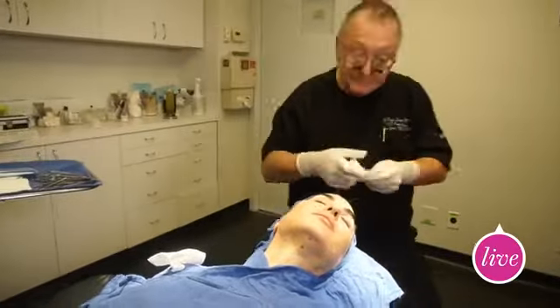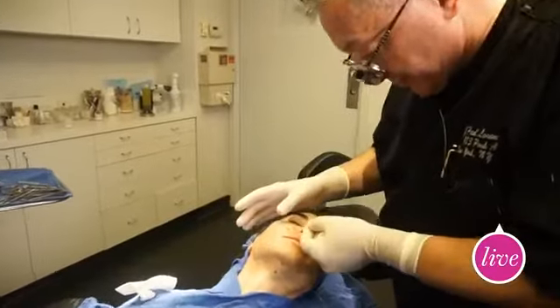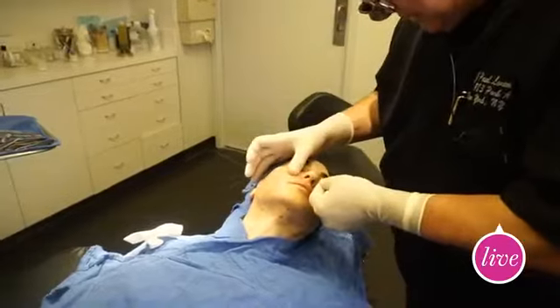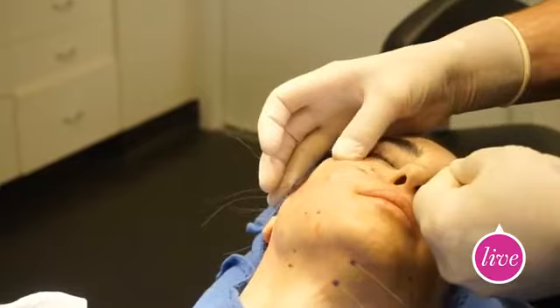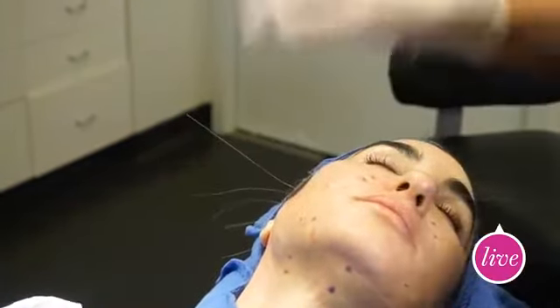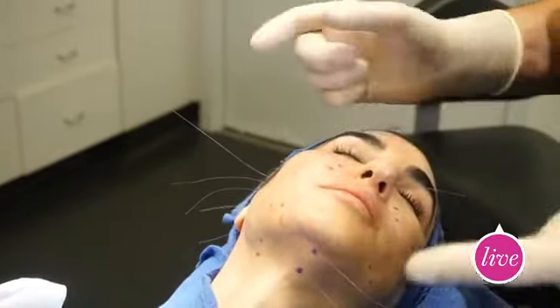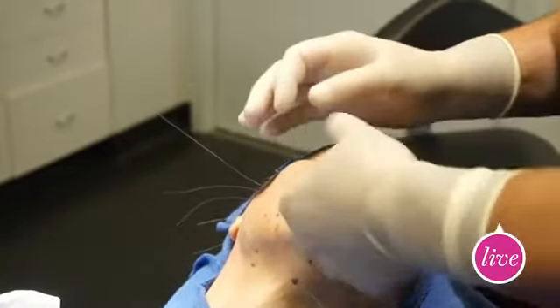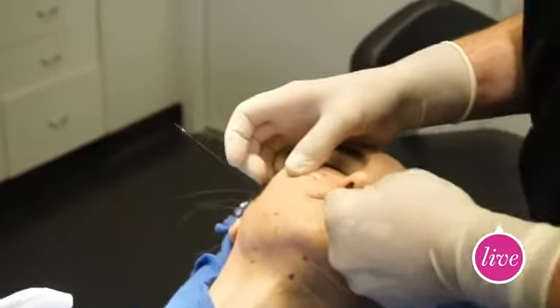And then what I do is I advance the tissue. So in the nasolabial fold, for instance, I'm just going to hold on to the suture and then advance the tissue. And you can feel these little clicks, and look what happens to the tissue. What exactly does advance the tissue mean? Moving it forward, moving it up to where it used to be. Got it, okay. So see the fullness, or the malar fat pad, as we refer to, it's now repositioned, and the same thing I will do with the other suture. And Stacy's comfortable. I'm not hurting you, am I? No.